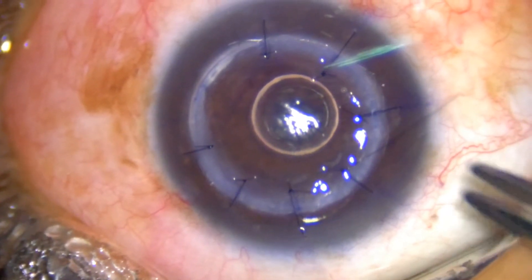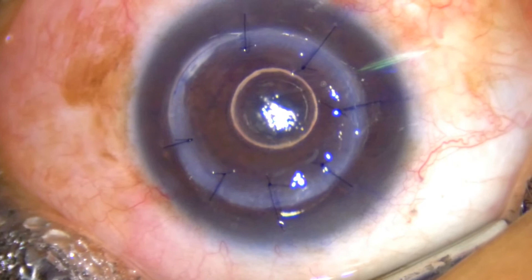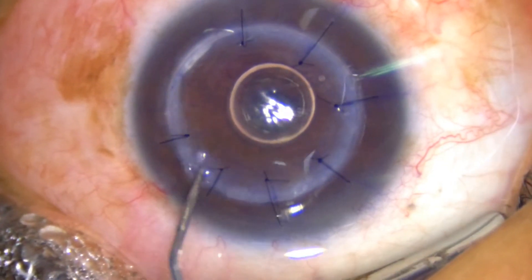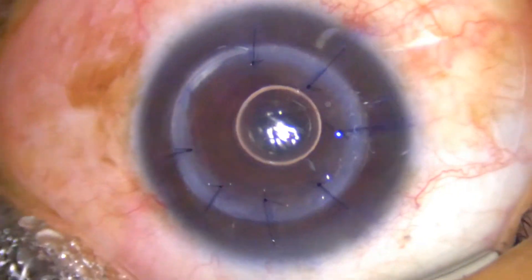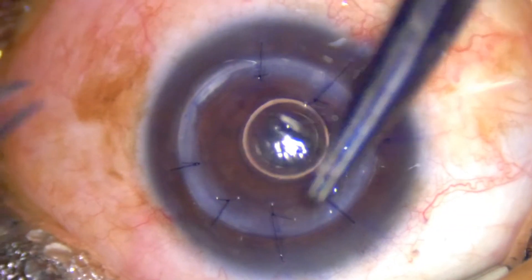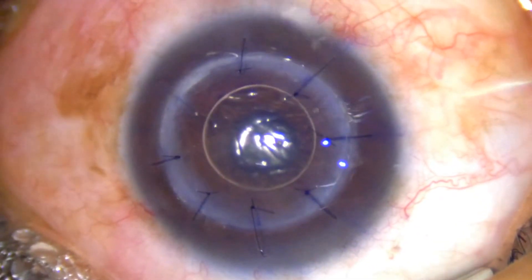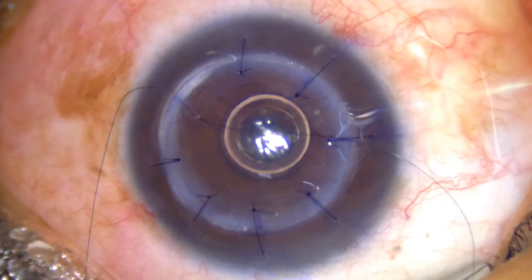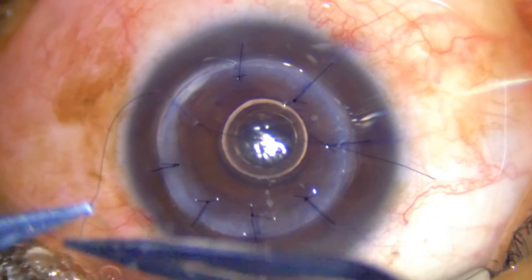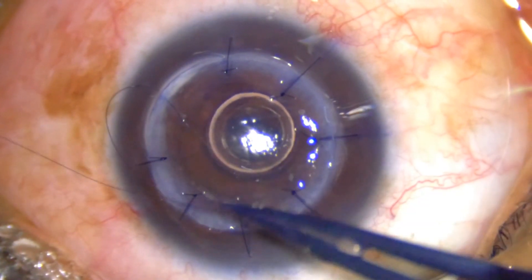The air bubble at the end of surgery is very regular and circular, which shows that the tension on all sutures is quite good.